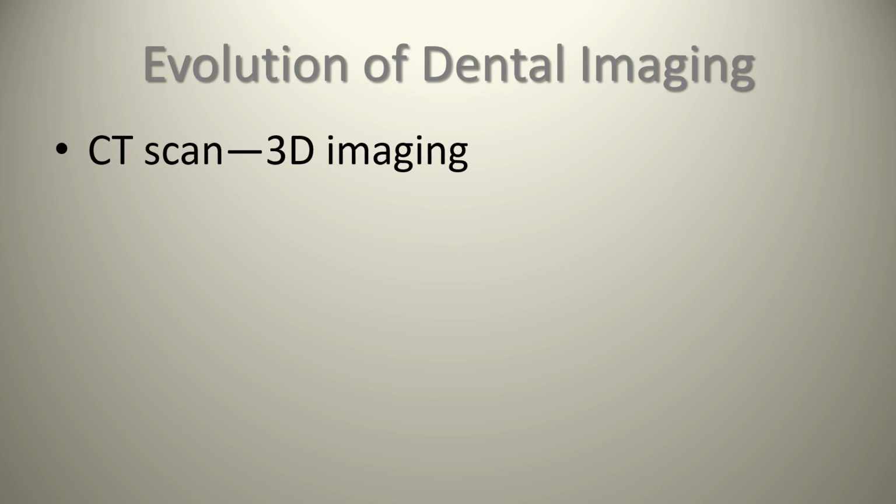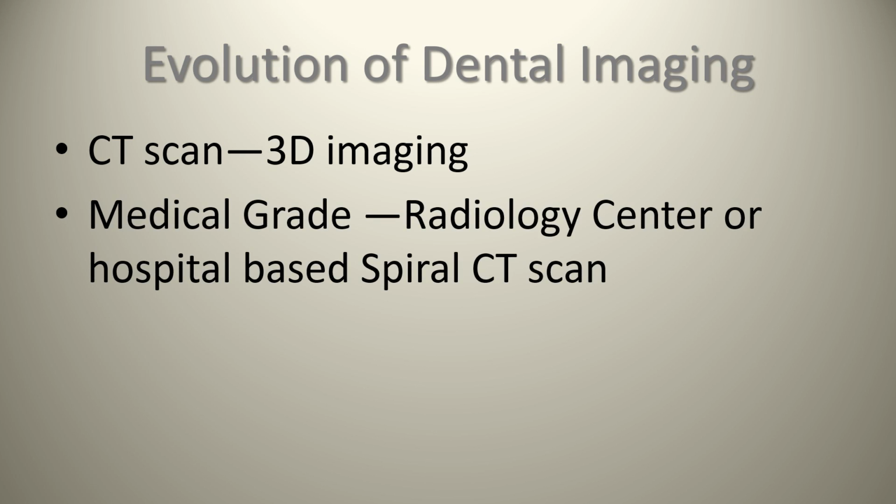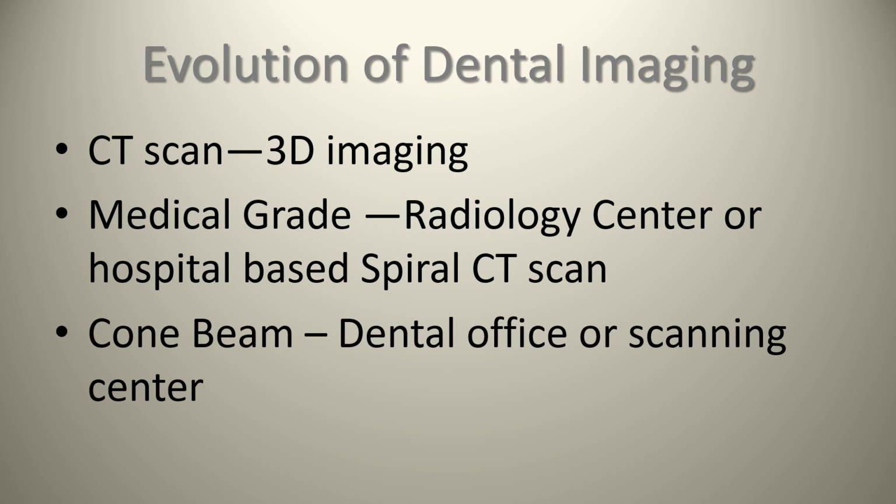So we did get the CT scan. This is the standard CT scan, not the cone beam CT scan, which was 3D imaging, and this would provide us with some sort of medical grade radiology capability. However, the cost of having a CT scanner in your office was just unfeasible. So usually this required sending the patient to some sort of radiology center or hospital-based spiral CT scan facility. Cone beam CT did come onto the market as a tool that could be available in a dental office or scanning center, and it would provide us with more capability.